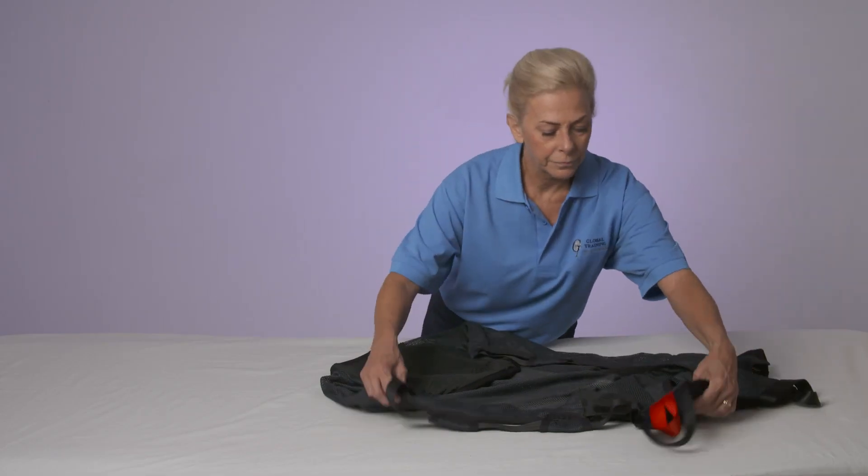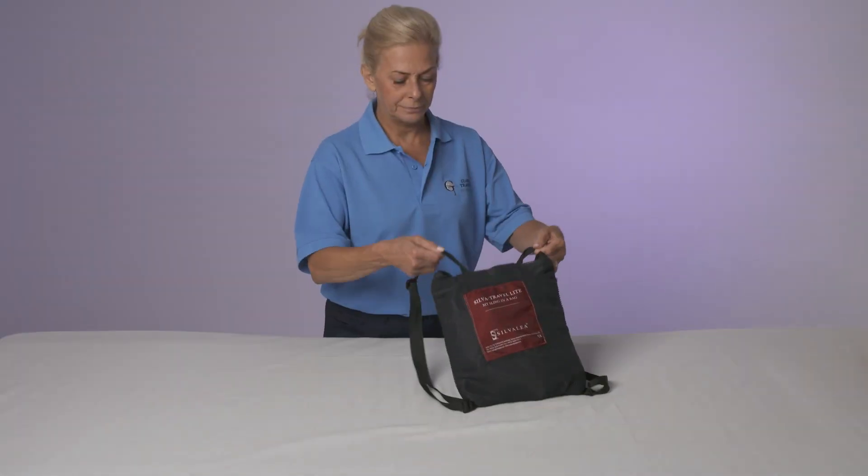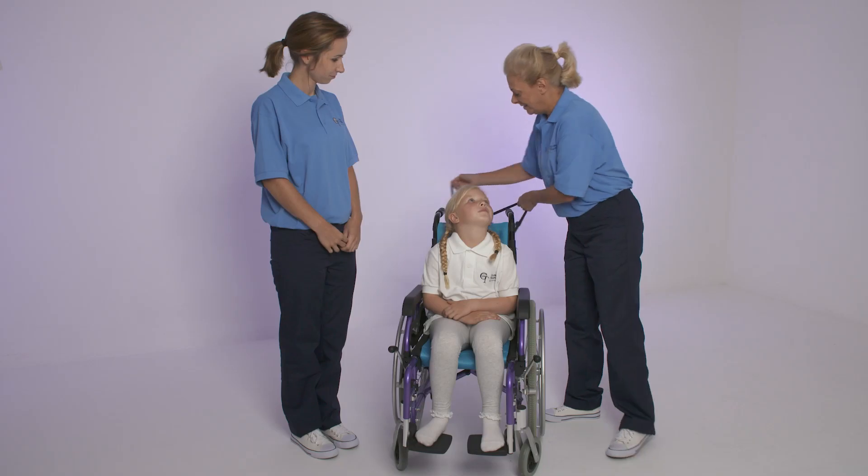Weighing just one kilogram, the versatile sling folds neatly to become a small self-contained bag. This can be worn as a backpack or attached to the wheelchair.